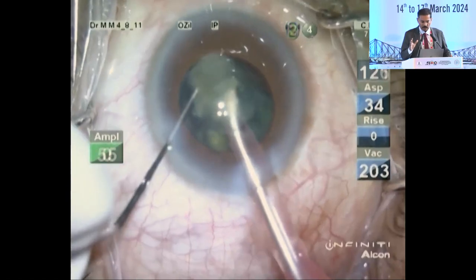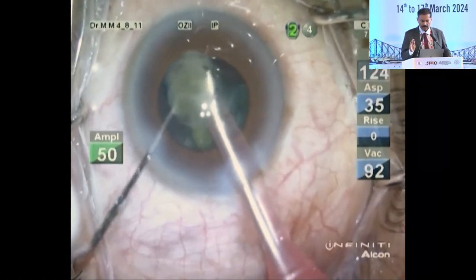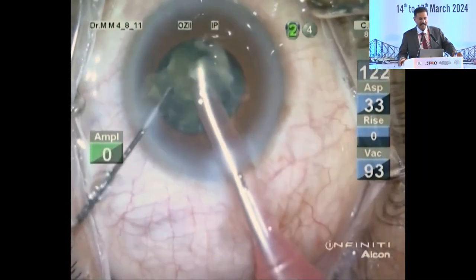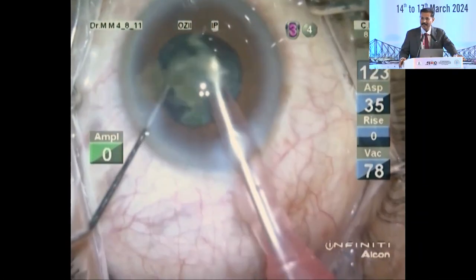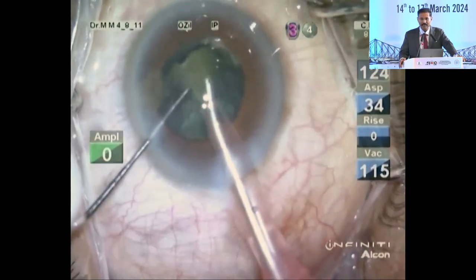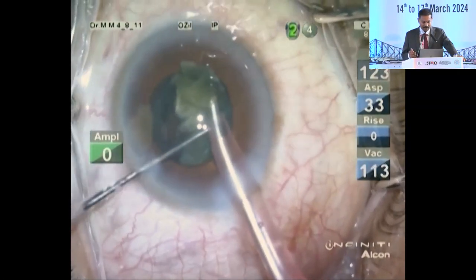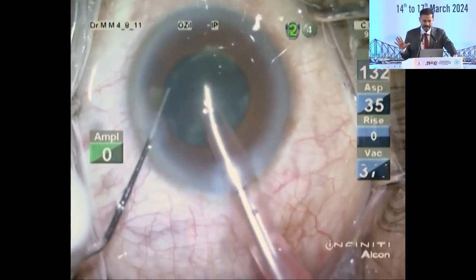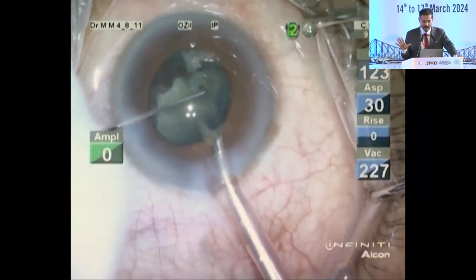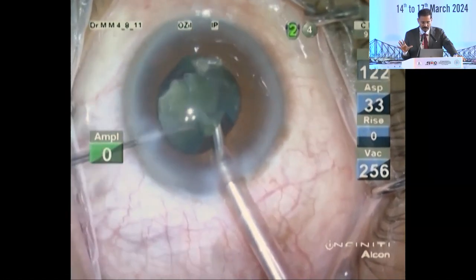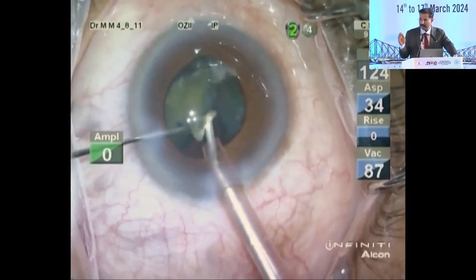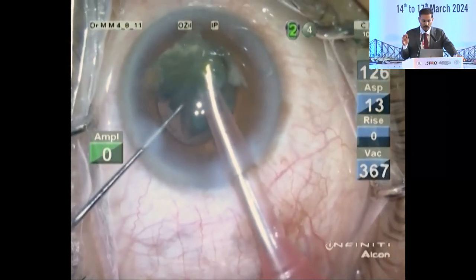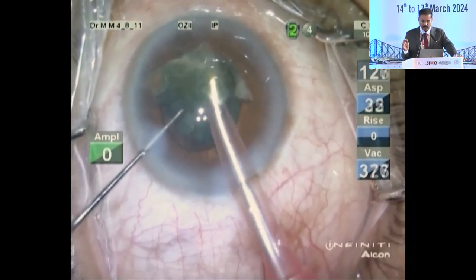The pupil is slightly small. There is no vitreous. This was done in 2011 when I was much younger and much bolder. So I am going ahead with the FACO, but the movements are controlled. I have not changed any settings — I think that is the wrong thing to do when we are bolder. Things should happen away from the area of the capsular rupture, slowly, your flow rate should come down, and vacuum should be used minimally.